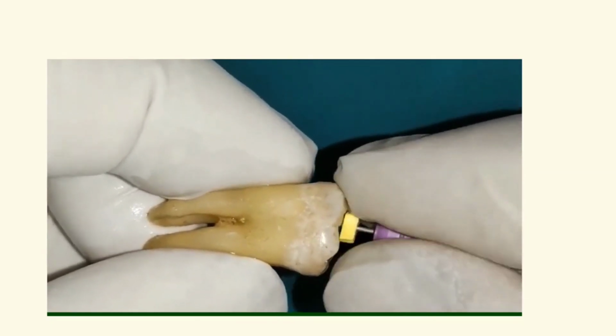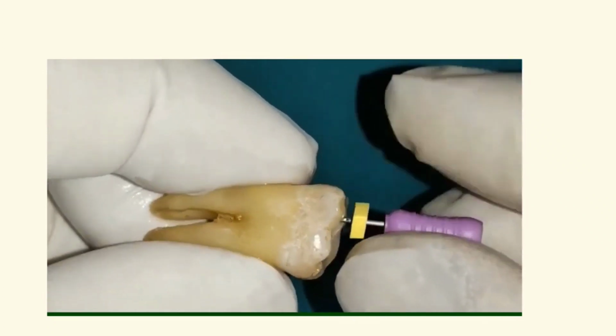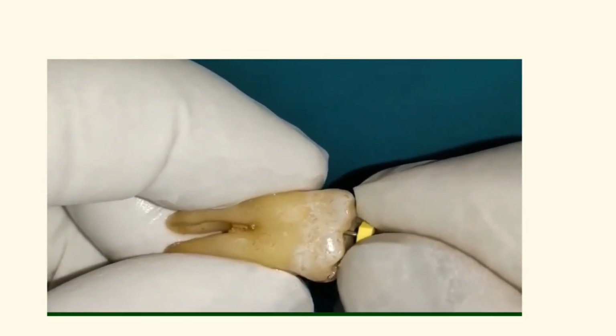This is very gentle watch-winding motion. You can see, don't force or push the file, otherwise you will definitely create a ledge or canal blockage.